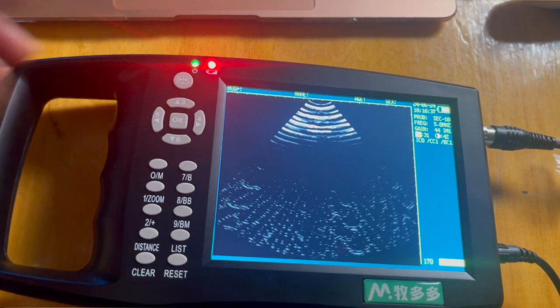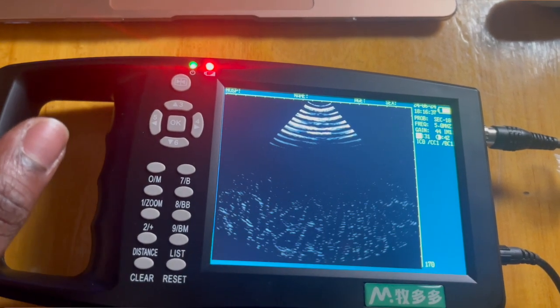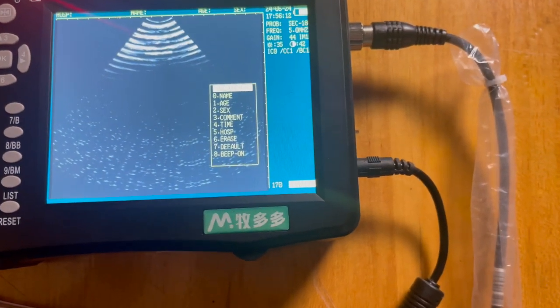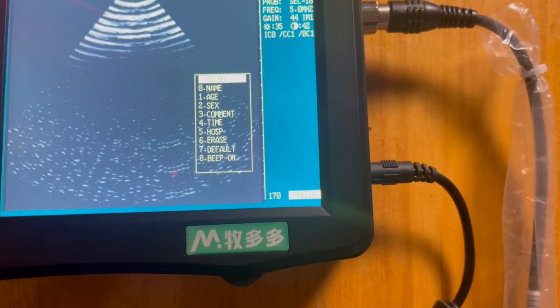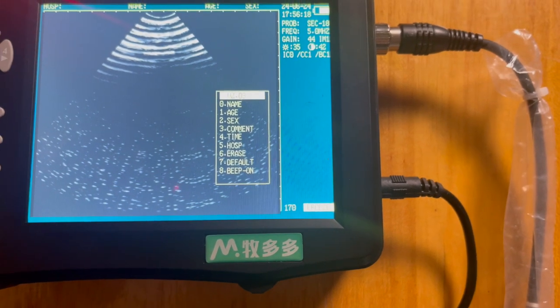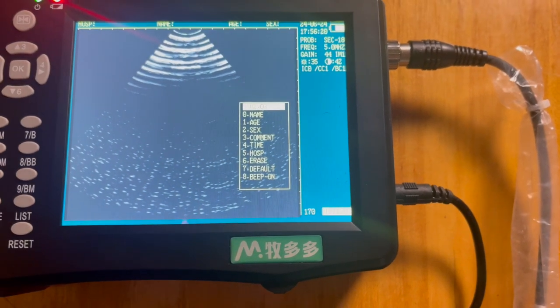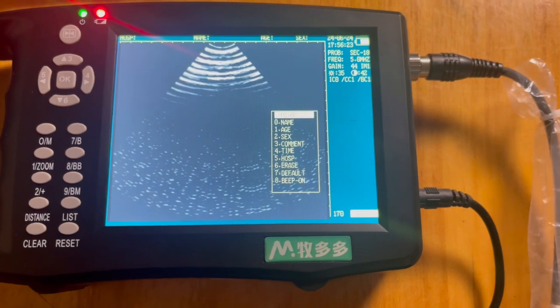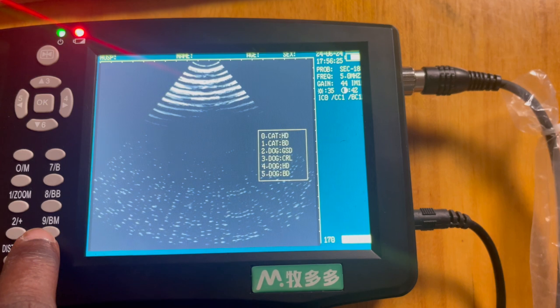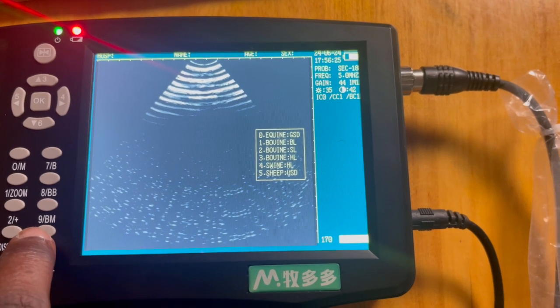When the image is frozen, you can press OK and a dropdown list appears to enter the details of the scan. If you have given your animal a name — whether it's a cat, a pet, or whatever — you can enter the name, age, and details of the examination. This way, when you access the results later on the scanner or on a computer, you will be able to know specifically which animal that result relates to.